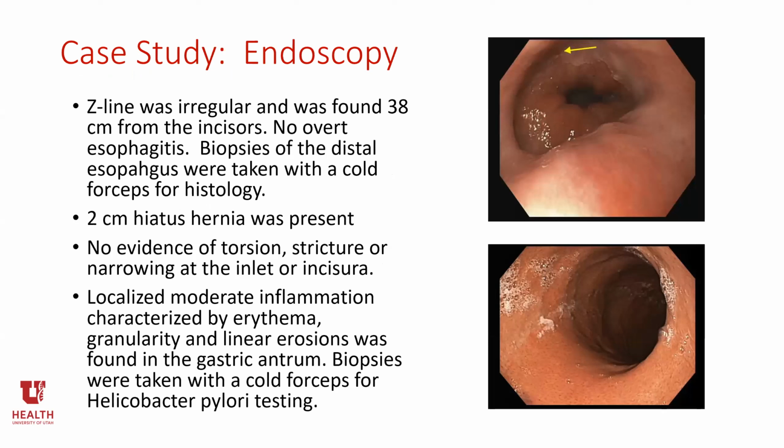And endoscopically, what I see here is that she's got a little recurrent hiatal hernia. So I measured that at about 2 centimeters. But the scope really seems to shoot straight down from the esophagus into the sleeve. I didn't find it to appear torsed or narrowed, and it looks wide open there at the incisura. So I'm not really sure what the source of her problem is.